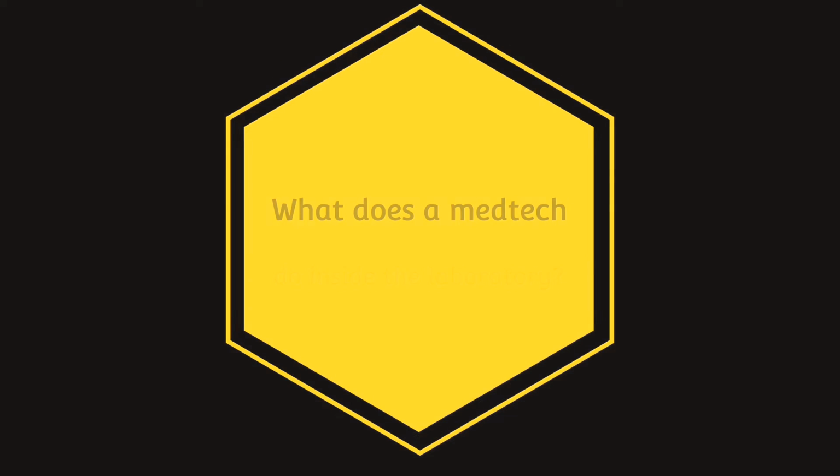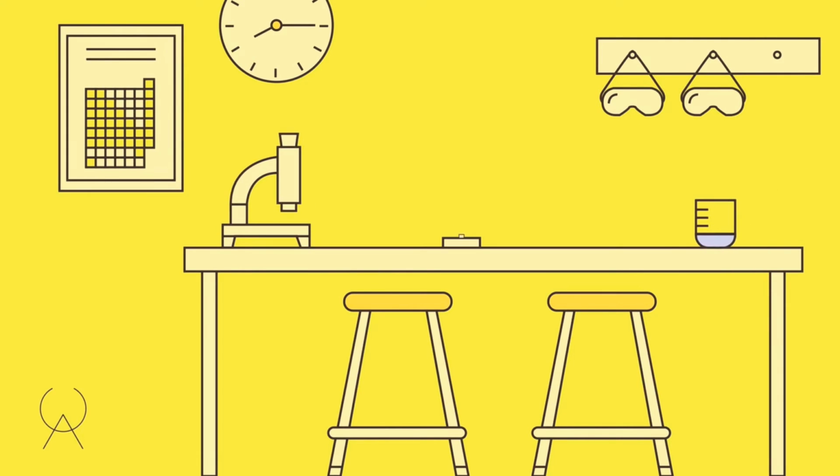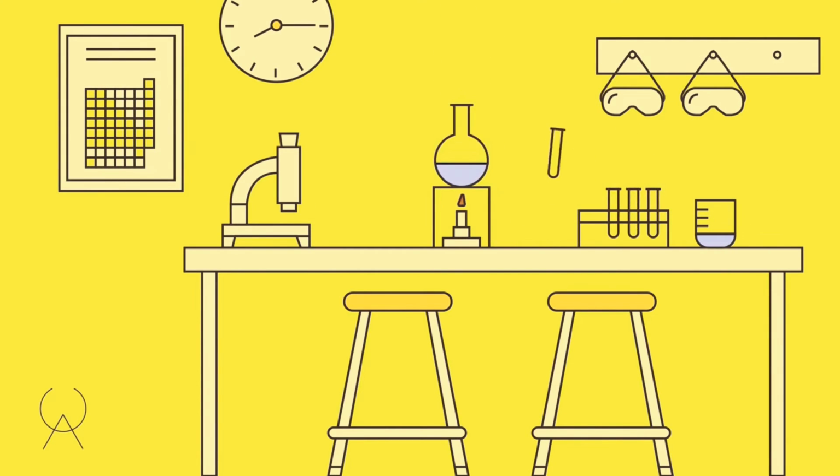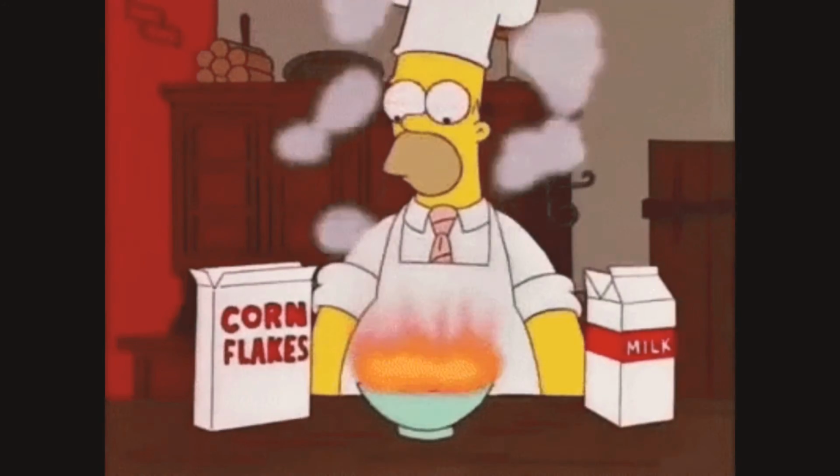But what does a medical technologist do inside the laboratory? Here, we prepare a 3D display of the medical laboratory to provide a full virtual representation and conceptual experience for aspiring medical technologists and individuals.